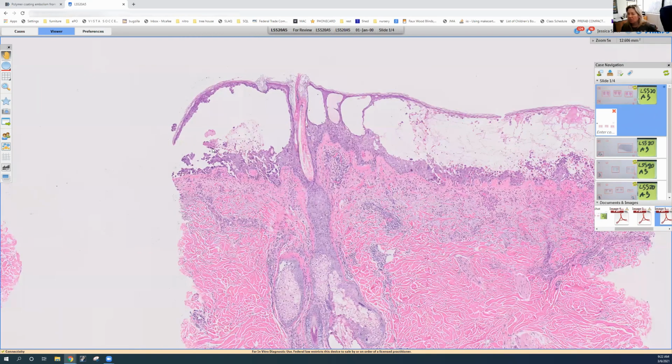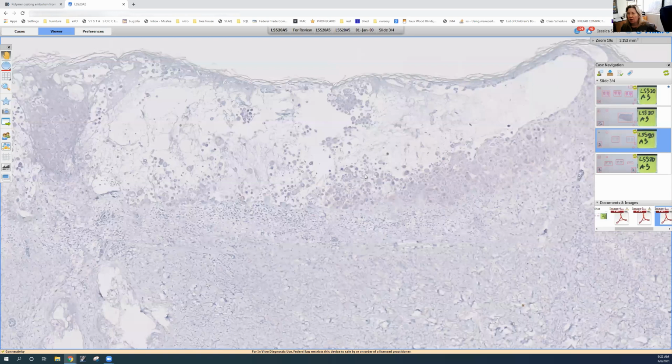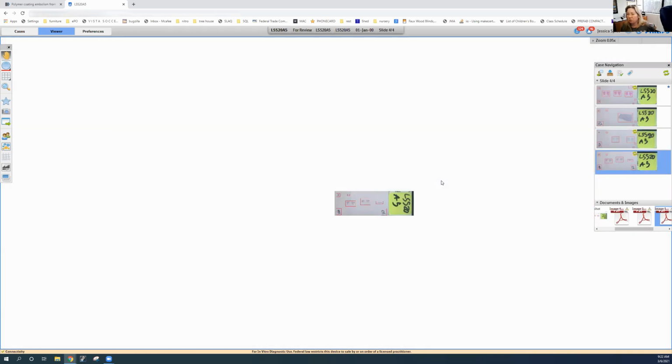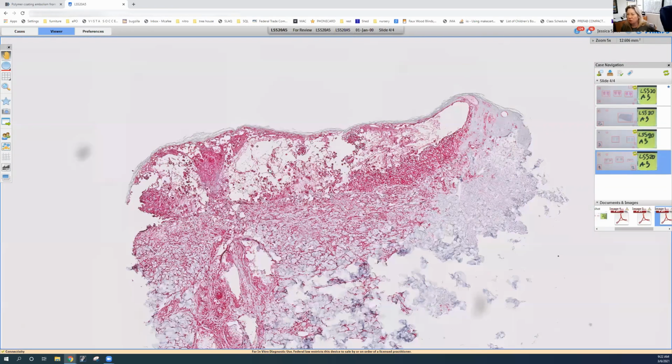In this case, I asked the clinician if he would like me to do immunostains to differentiate them, and he said, yes, please. Here is the immunostain for herpes simplex 1 and 2. You can see it's a red chromogen, and it's completely negative in these cells. And here's the herpes zoster immunostain. And bingo, this is an atypical presentation of herpes zoster. Really beautiful. Actually, we're going to keep this tissue for our control. Usually such a great specimen.